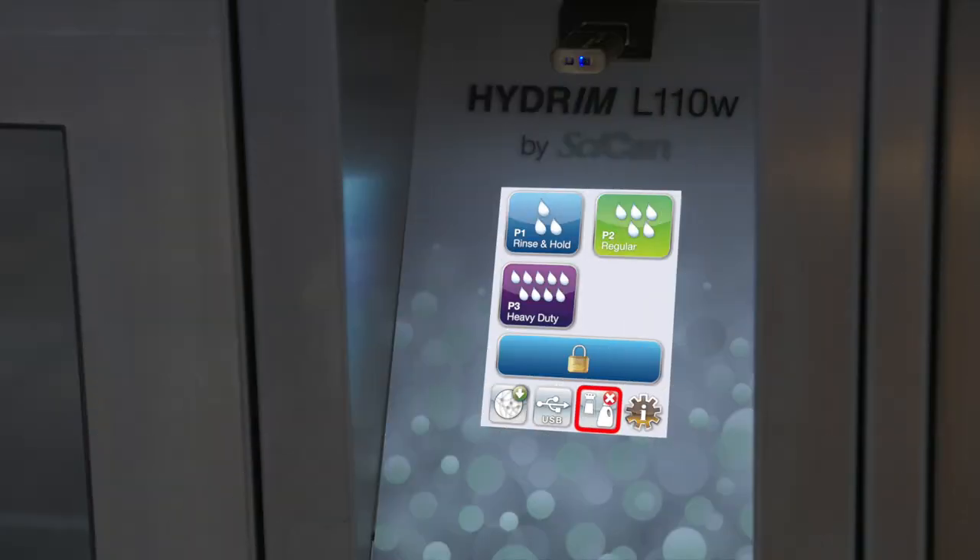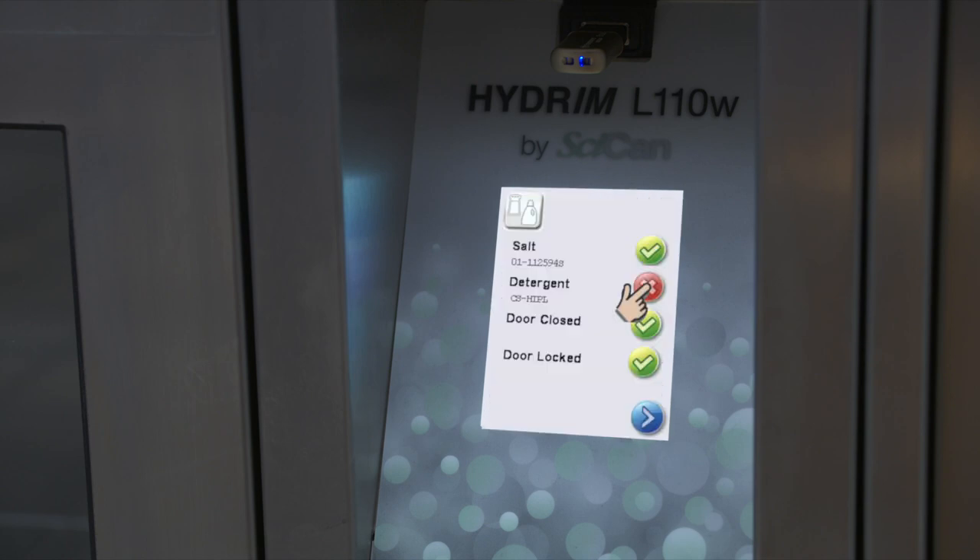Sometimes you might see a red X on one of the icons on the main screen. Press the icon to determine if the HIP cleaning solution needs to be replaced or the water softener needs to be refilled.